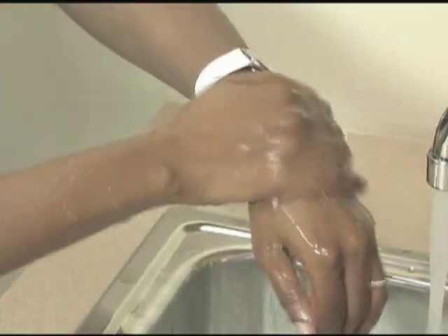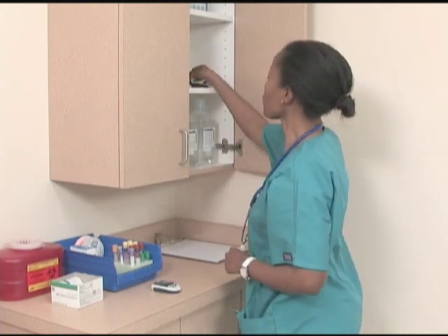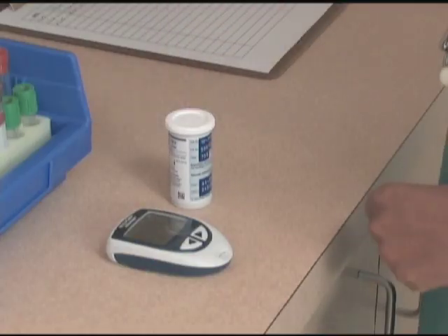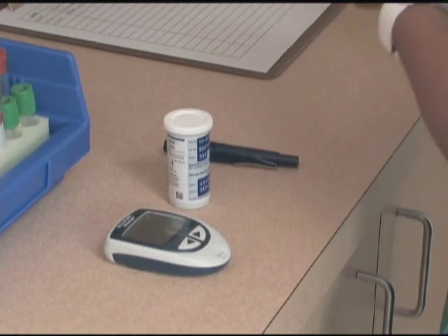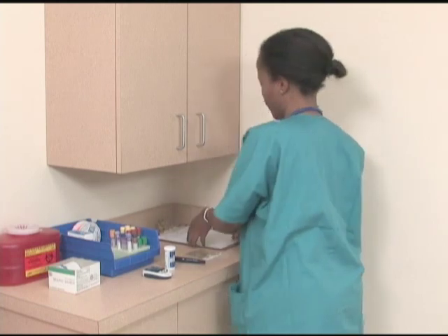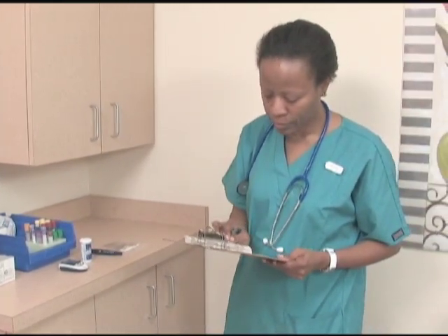Begin by washing your hands. Gather equipment and supplies. Check the equipment log to verify that calibration and quality control have been performed and are acceptable.